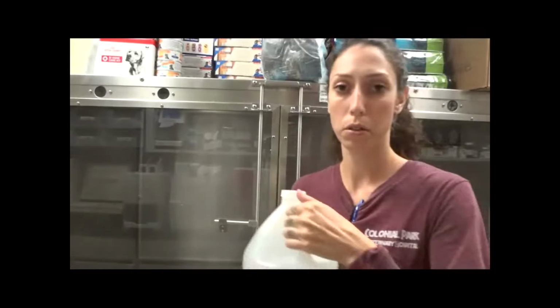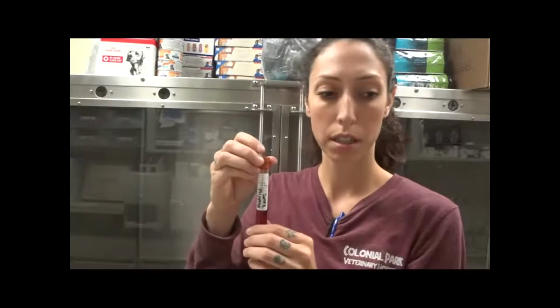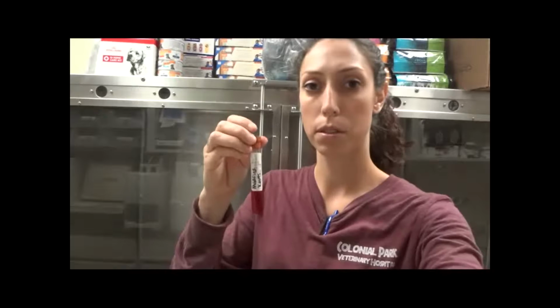To get our 2% formalin, we mixed 2 ml of the 37% formaldehyde with 98 ml of water. And now we're going to centrifuge this for 5 minutes at 1500 RPMs. Alright, so we've centrifuged our mixture of blood from the lavender top tube and the 2% formalin. We're going to discard the supernatant from the top, and then we will mix methylene blue with the sediment at the bottom and view it under a microscope.